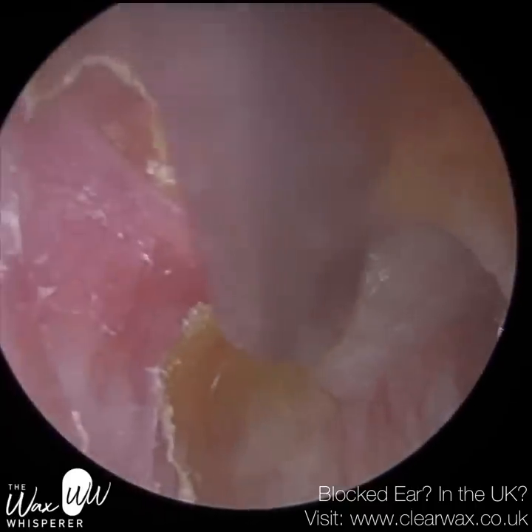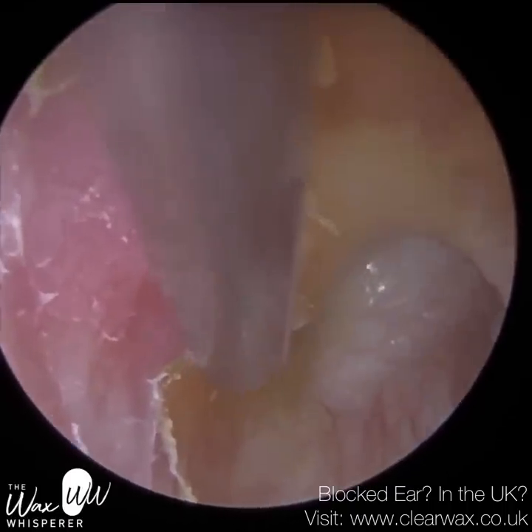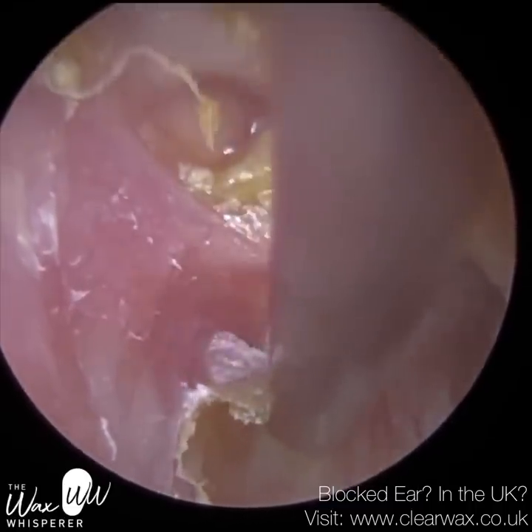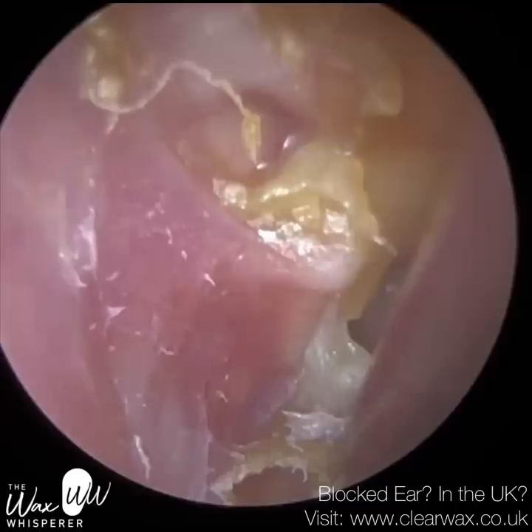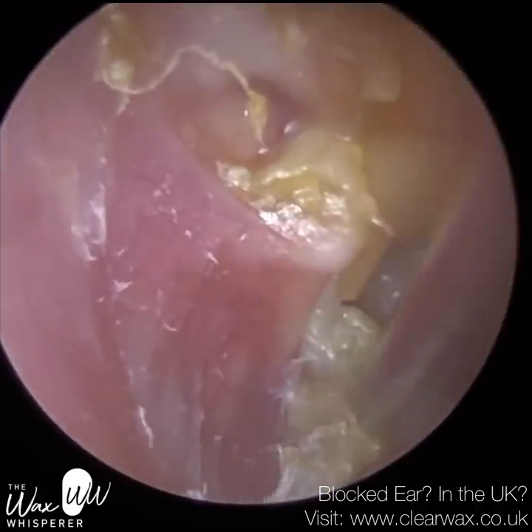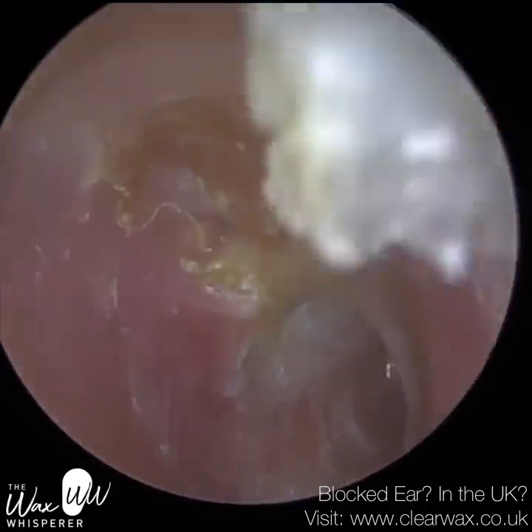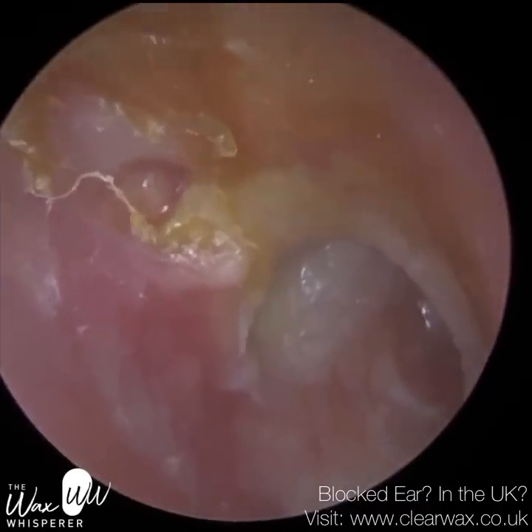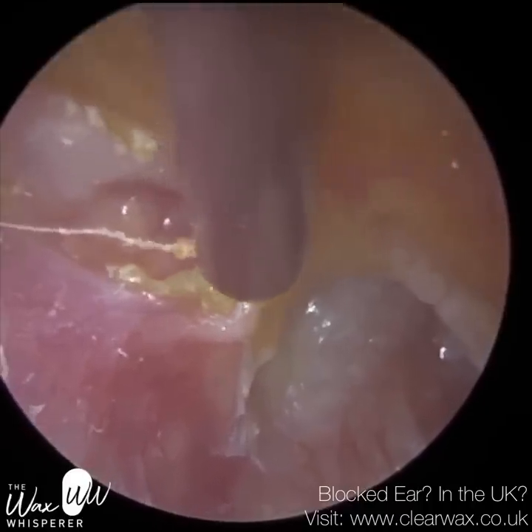This patient wears hearing aids and has been reporting that the ear is a bit damp. Upon first inspection there was some dampness on the dead skin lining the ear canal, but we weren't able to see underneath. Upon removal, we can see this patient has got a very deep posterior superior retraction pocket with some dead skin occupying that space — and that's how a cholesteatoma can start. You can see where the hammer bone is protruding out — there's a pocket there, a retraction pocket. Dead skin is collecting in that pocket; if it can't migrate, it's trapped, it can form into a plug, get infected, and we call that cholesteatoma.